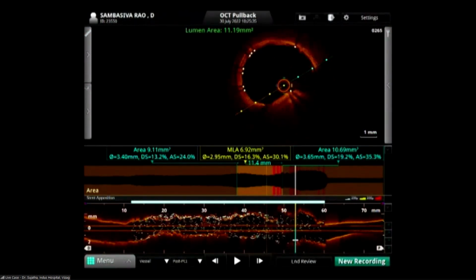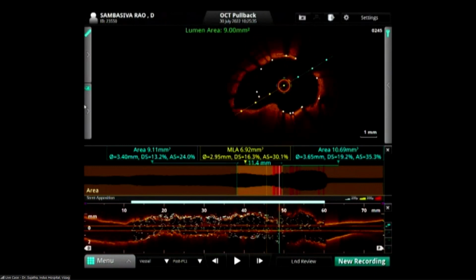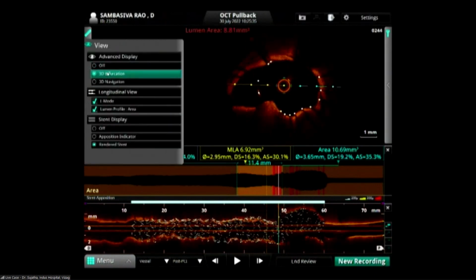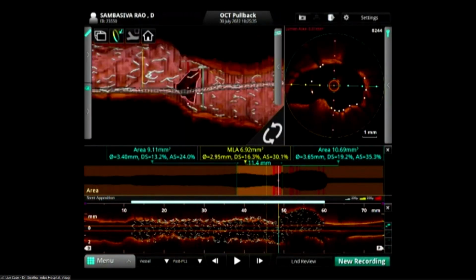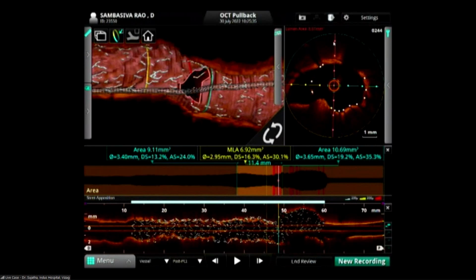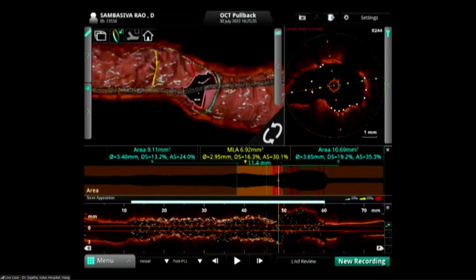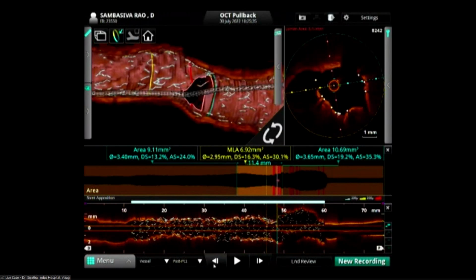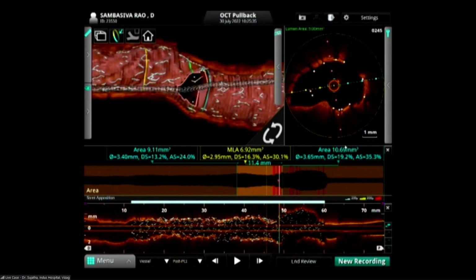We just want to show the stents across the circumflex. Okay, can you show the 3D view, because my strategy is to look at the struts across the circumflex and do it only if there are any. It's beautiful. Otherwise, imaging helps us do this. Also in bifurcation lesion, fortunately there are not many struts. Only one thing which is seen on the opposite side. I think a perfect demonstration of LCX ostium by OCT. That's the beauty of this technology.